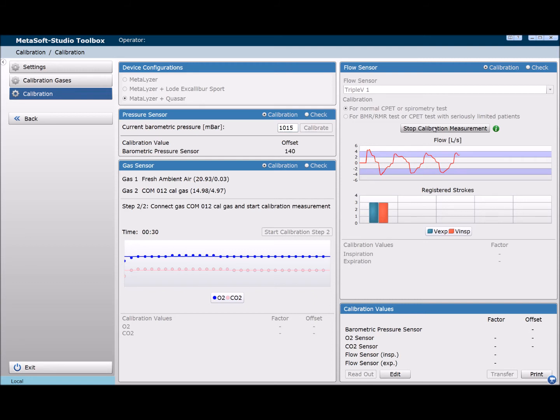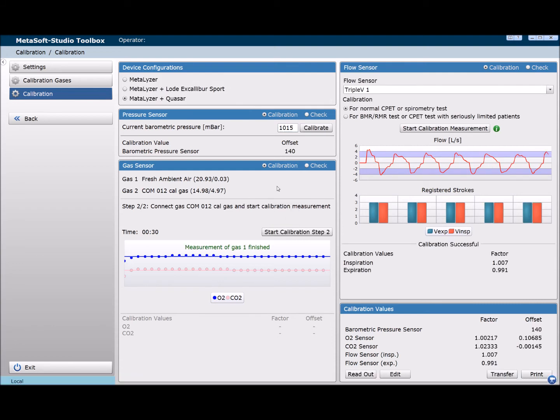Once five valid strokes have been registered, click transfer to complete the process. If more details about the calibration are required, click the readout button. Once your calibration is complete, open Metasoft Studio and click ARU test.